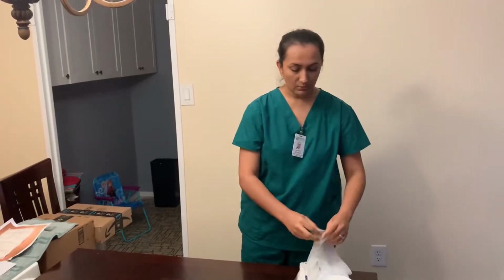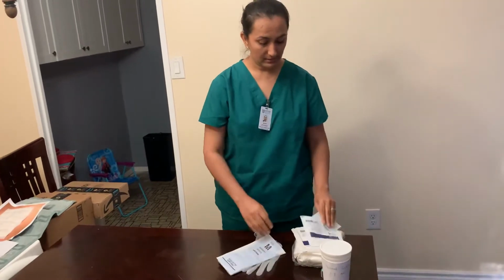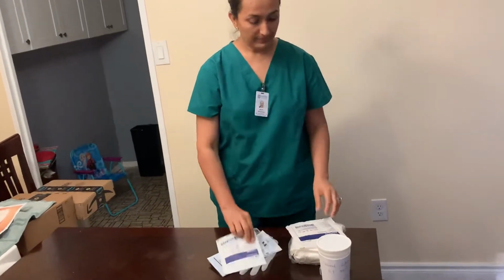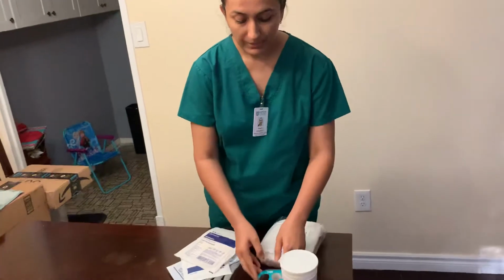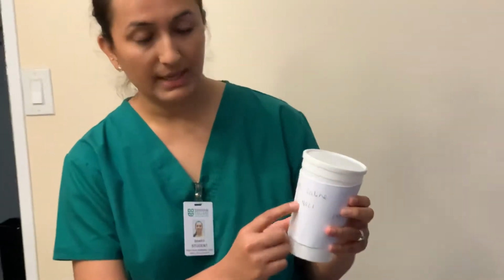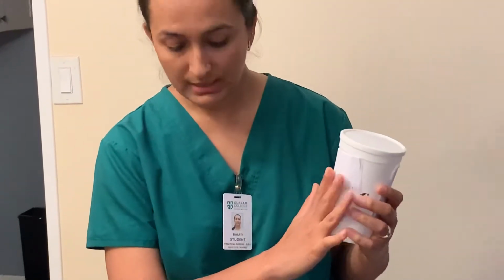I'll gather the supplies. So I'll need one pair of clean gloves, one pair of sterile gloves, one 2x2 gauze, one 4x4 gauze, and one abdominal pad, a sterile dressing tray, tape, and the normal saline solution 0.9 NaCl. The expiry date says January 2021. I checked, so it's good to use.